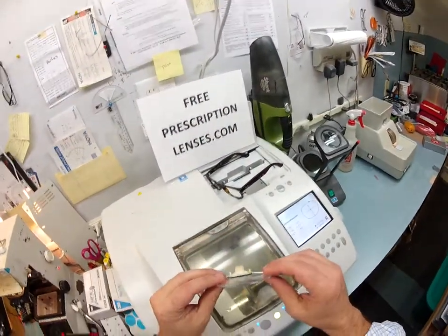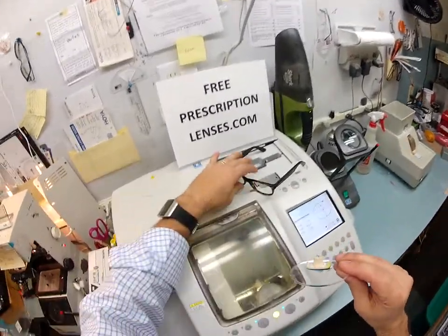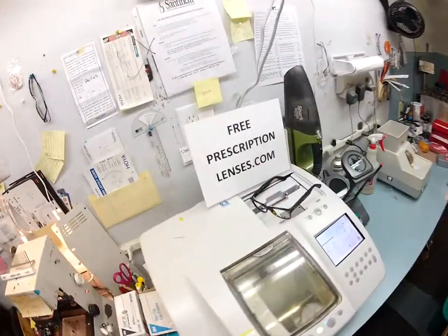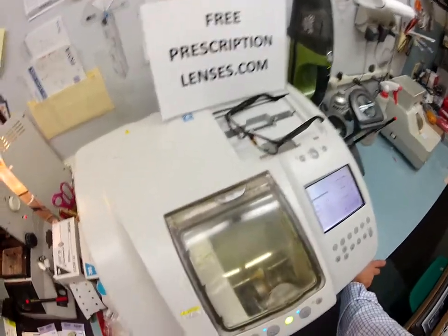You can see how flat the lenses are and how good that's going to look inside the frame as a finished product. Anytime you buy a frame from me, everyone gets free clear lenses or free prescription clear lenses.